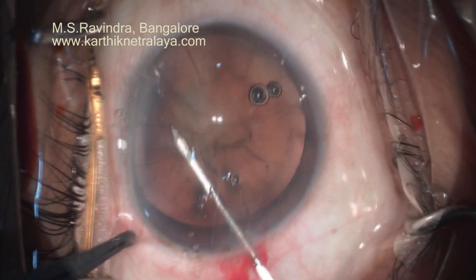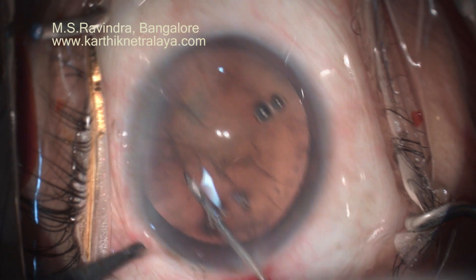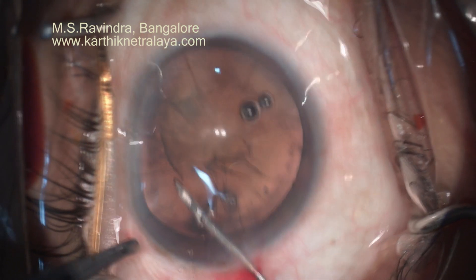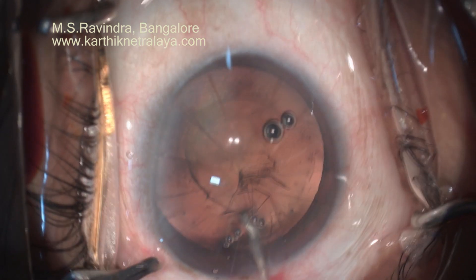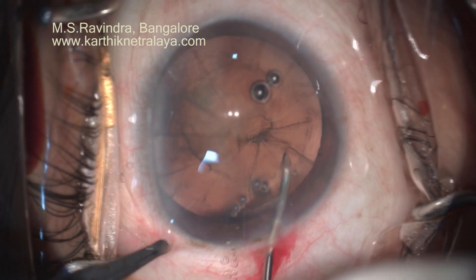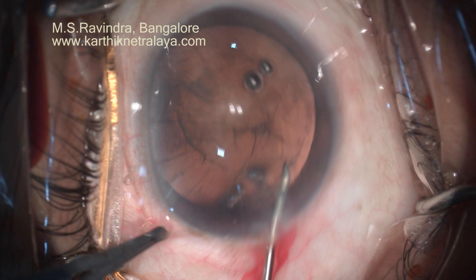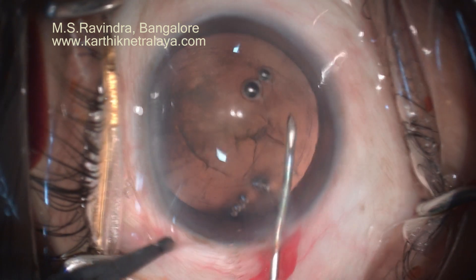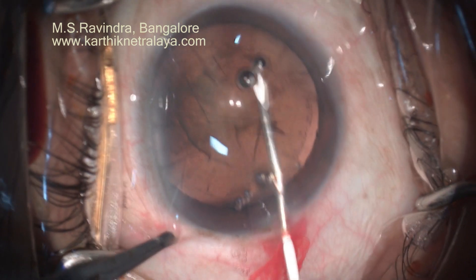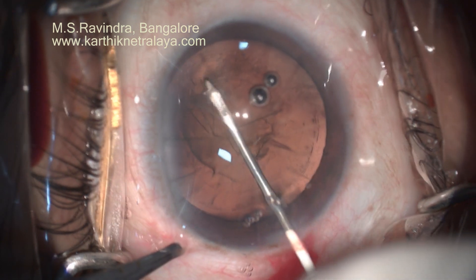The anterior chamber is refilled with viscoelastic before the rhexis was completed because the AC was shallowing. In spite of the tunnel floor entry technique, this ensured that a good-sized rhexis is obtained so that the zonules are not traumatized during nuclear prolapse, ensuring a free-floating anterior capsule.